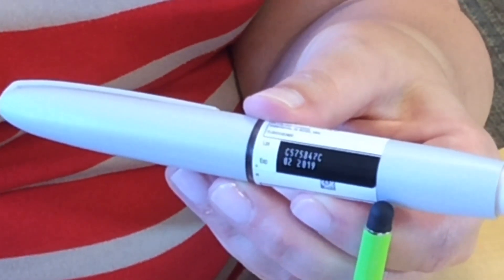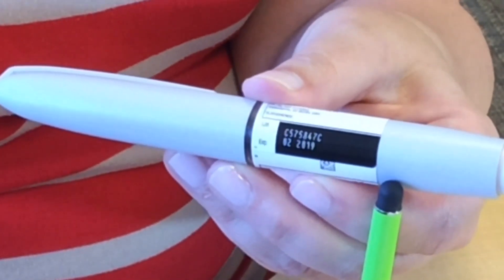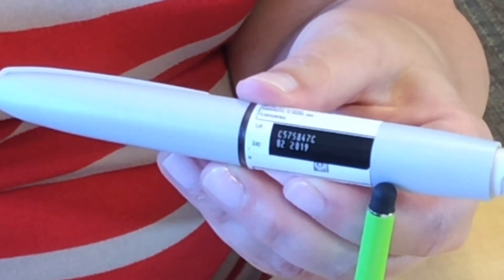The expiration date listed on your pen is listed as a month and year. This means you have until the last day of that month to use your pen.